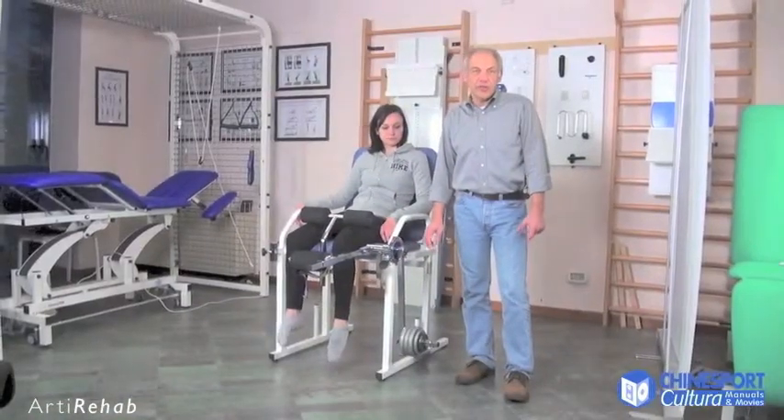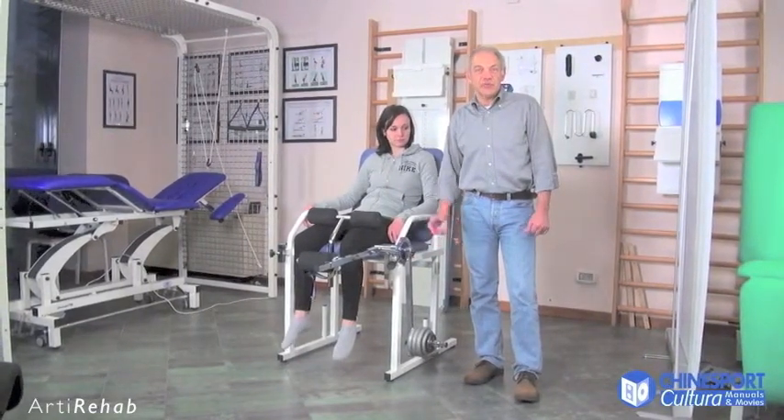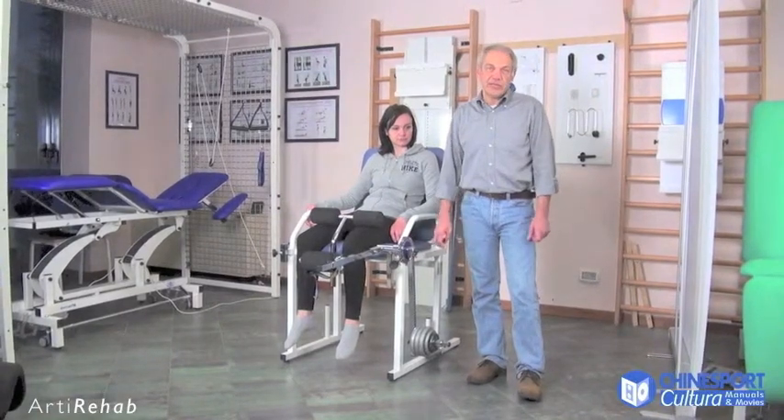Arty Rehab is used for a rehabilitation program set up to regain full functionality of the extensor and flexor muscles in the lower limbs.